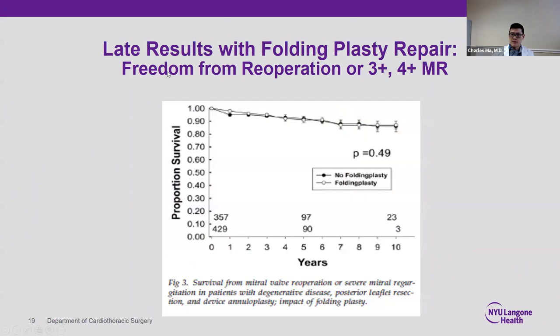So what's our data from this compared to the standard mitral valve repair? Well, the freedom from reoperation or moderate to severe MR at 10 years was excellent. It was 90% with the folding plasty and without. So we proved that this technique was equivalent to the traditional repair in terms of durability and outcomes.